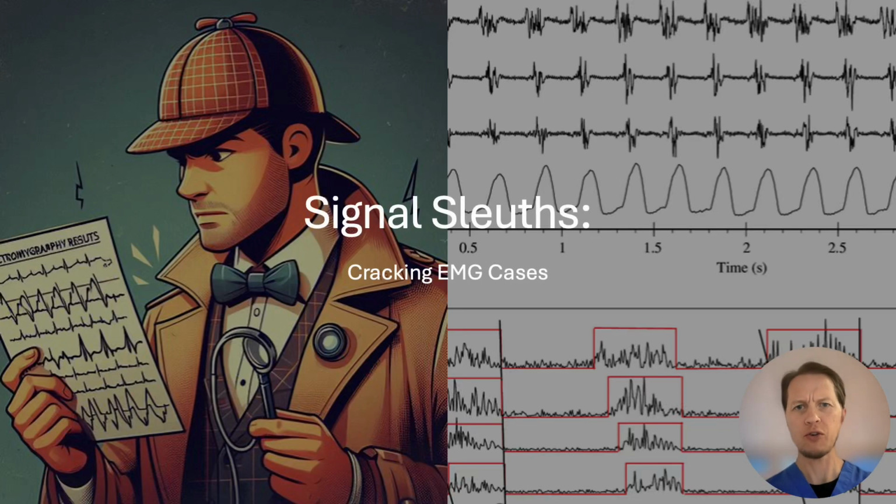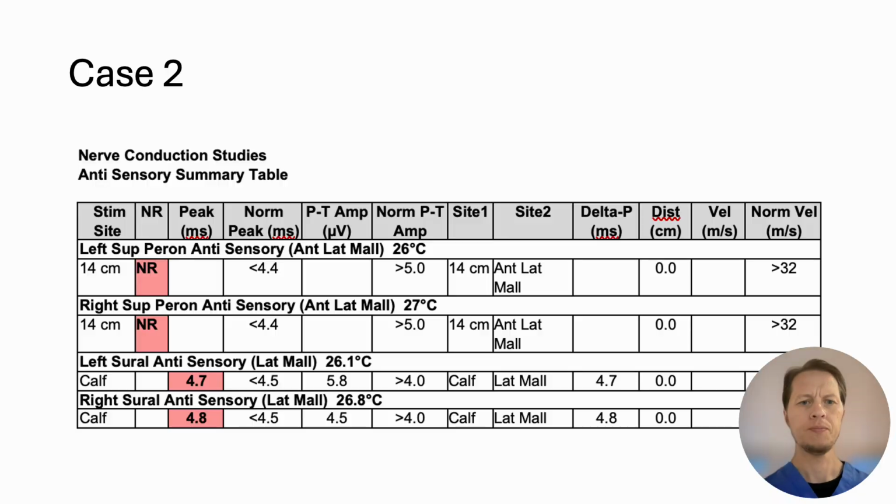We are going to be cracking some EMG cases, more likely just reviewing them. I'm Ken Vitale. I'm a physician in San Diego. I work at the University Hospital and do a lot of EMGs for orthopedics. I come across some interesting cases, like this one.